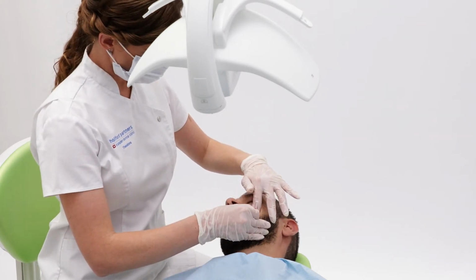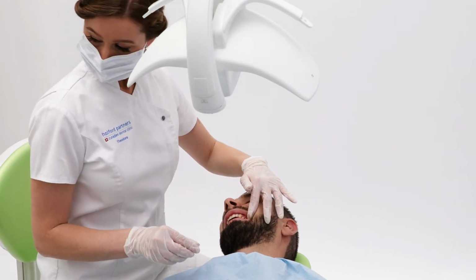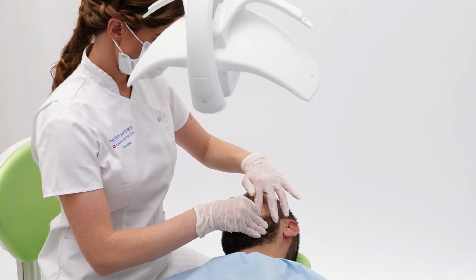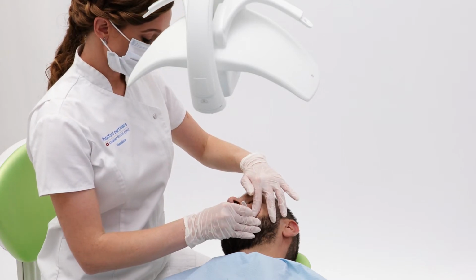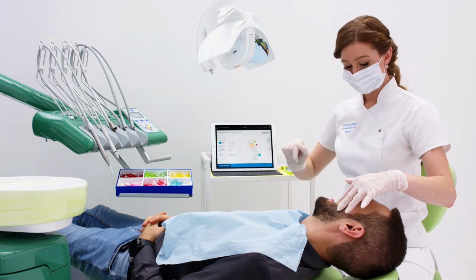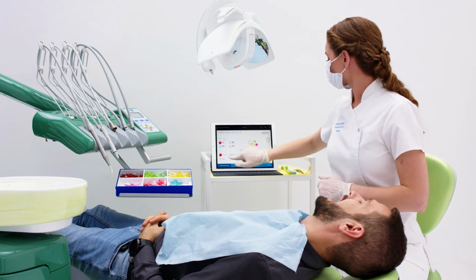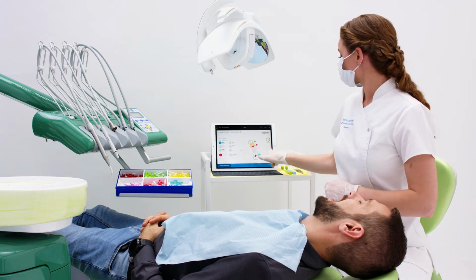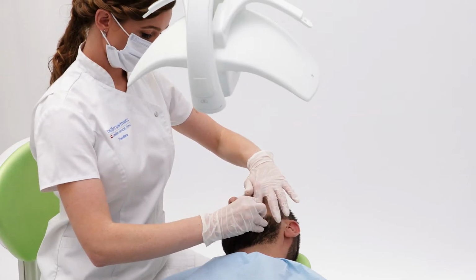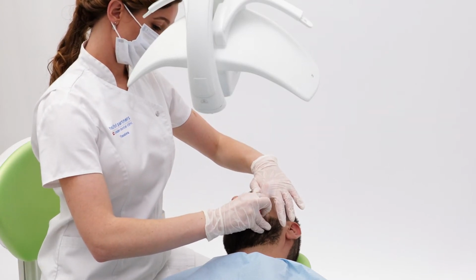I decide that the pink I input from the IAP here will not be so accessible and easy with the interdental brush for the patient, so I change it to a prime turquoise on this occasion. Moving on to the lower left sextant, I continue with the interdental brushes and inputting any bleeding present.